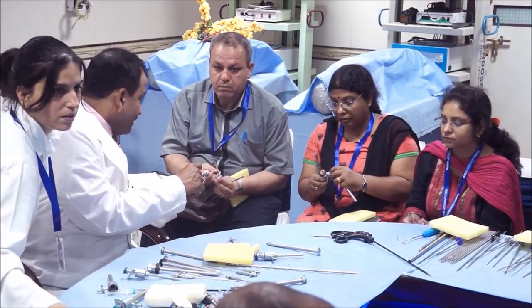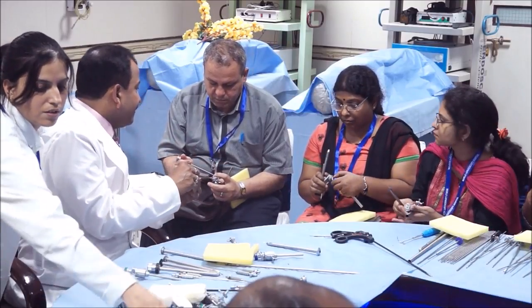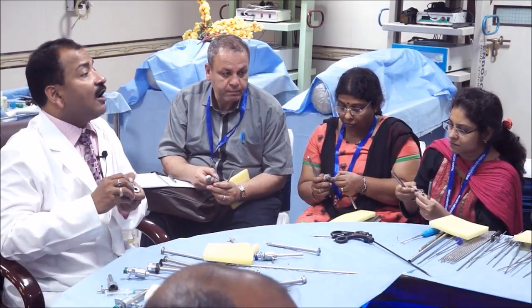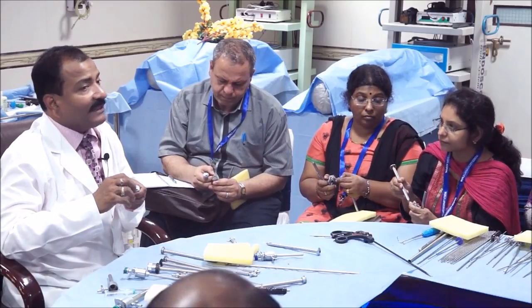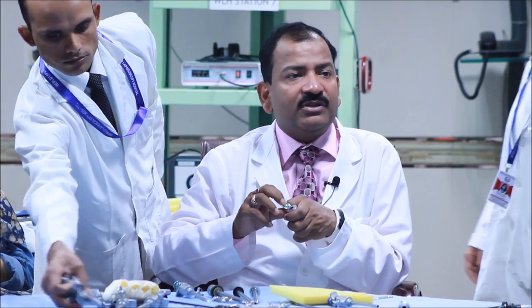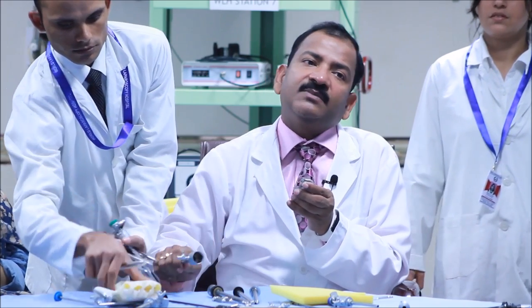Here. Yes, that one. Can you see the surrounding? Yes, that one, exactly. This is a rubber seal. This rubber seal should not be broken. If it is broken, you have to change it. Otherwise, gas will leak. It gives you a rubbery sound. See, this is a beautiful sound. If it comes as a metallic sound, that means it is broken.